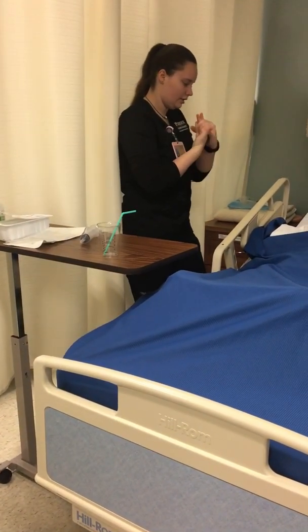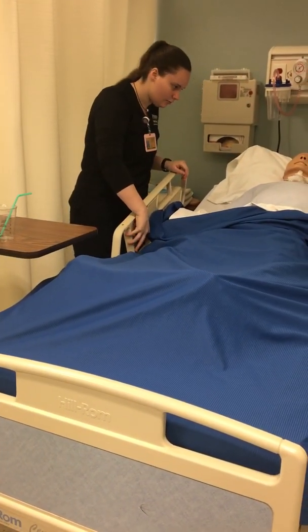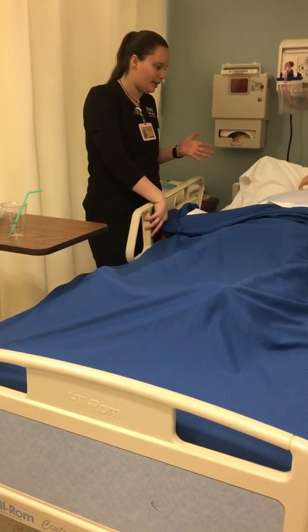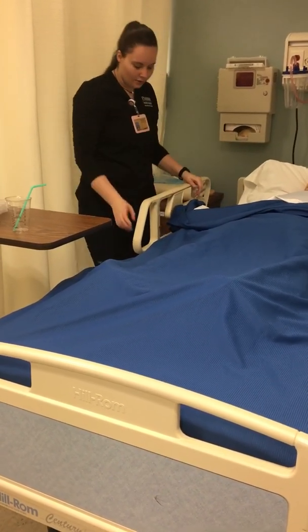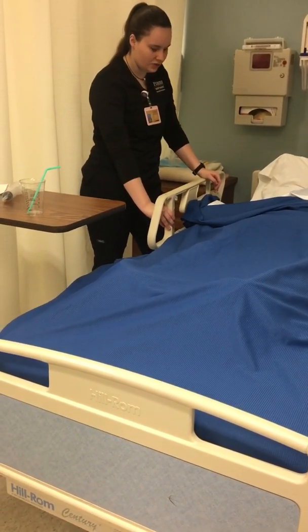I would lower the head of the bed. I should not have removed the side rail yet — I would replace the side rail and lower the bed to the lowest working position.